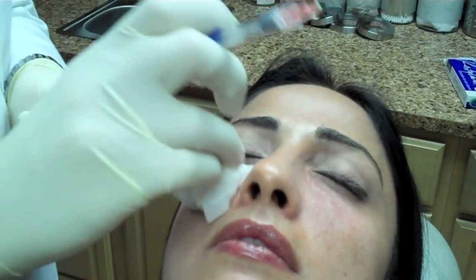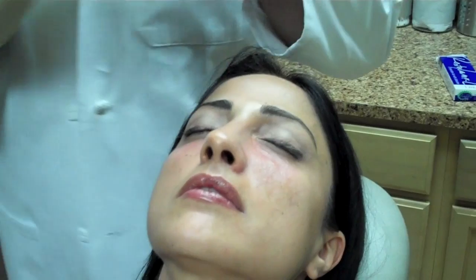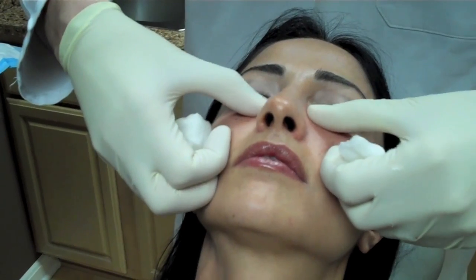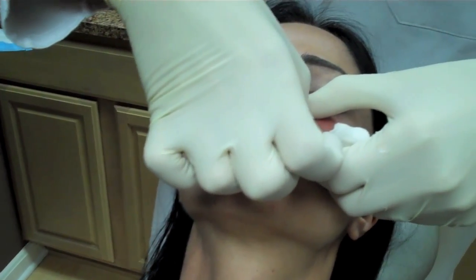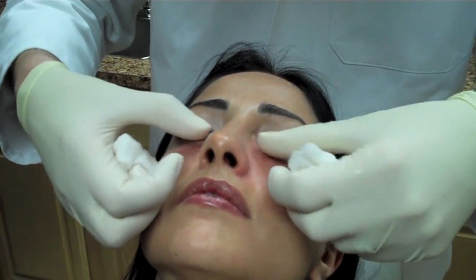That's it. No big bruise. You didn't really have any large bleeders that got in the way. I just like to massage this area, make sure it's perfectly smooth. And again, I don't feel any lumps or bumps. Any surface irregularities that we see is just swelling from around the injections, kind of micro bruises. But there's absolutely nothing that's palpable as a lump.